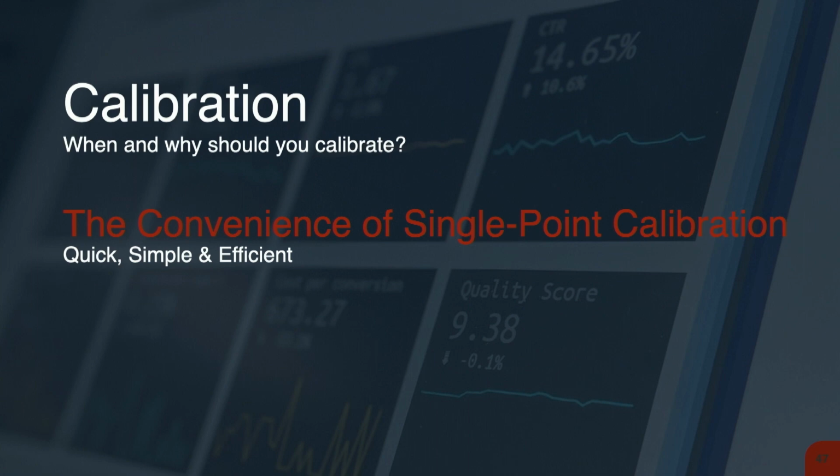So calibration, I spoke about this very briefly, but calibration is very important because this is how you make sure that your printer is accurate and precise, right? So why is it important? When should we do it? Why should we do it? So with Asiga specifically, they recommend that you check your calibration every 20 to 30 builds.